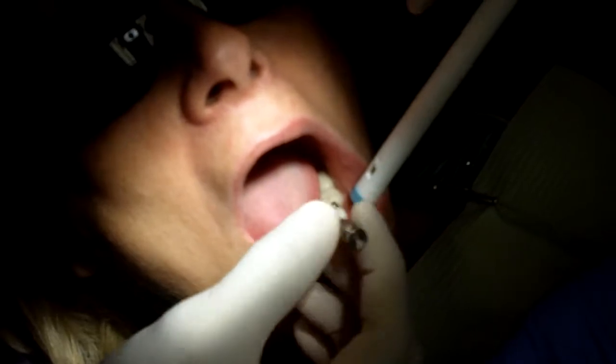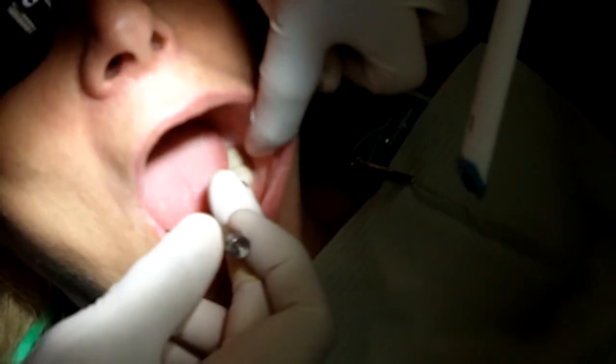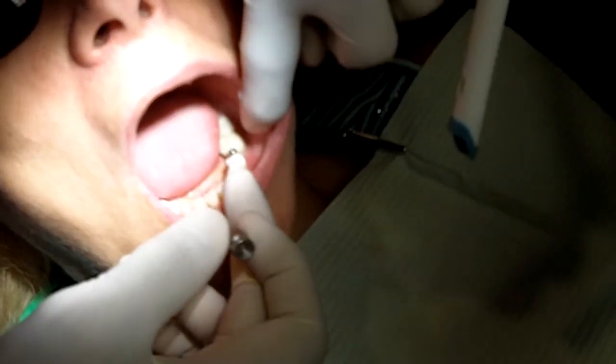So as we just seen there, implant components are notoriously small and so they're going to slip. If they do slip, SafeVac will catch it right in the internal screen, thereby eliminating the possibility of our patient inadvertently swallowing that component and having a bad day in the dental office.